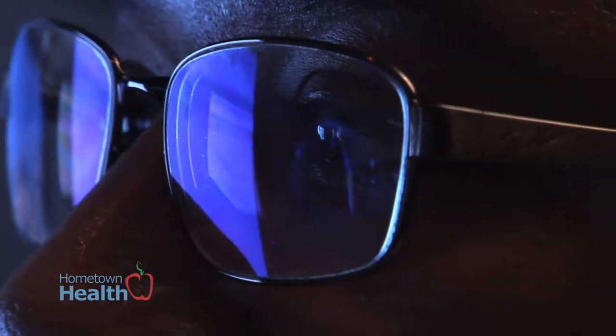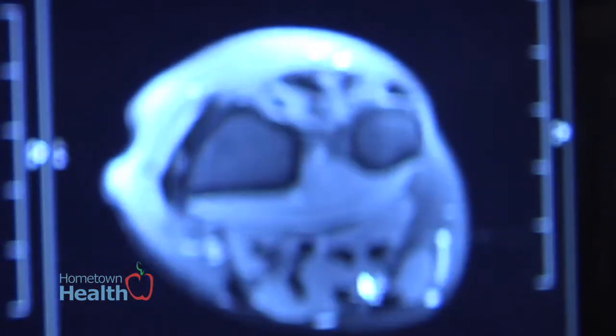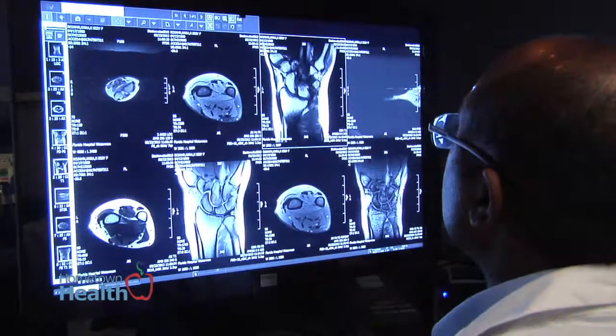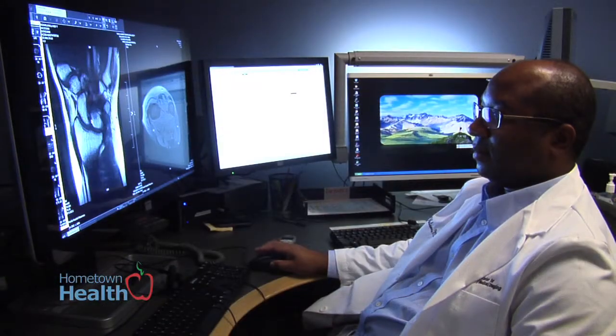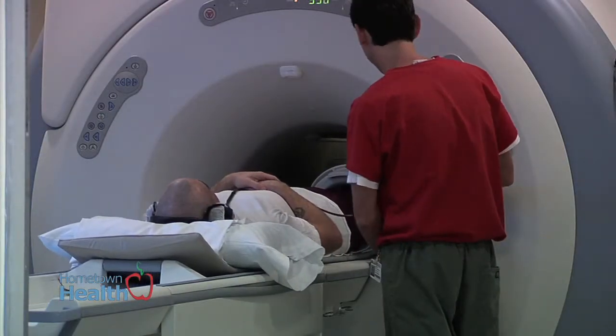In MRI, there are three main findings that we are able to detect in patients that have inflammatory arthritis. The first is synovitis. Synovitis refers to an inflammation of the lining of the joint. So on MRI, we can detect increase in volume of synovial fluid, because in patients with an inflammatory arthritis, a greater volume of fluid is produced. This is long before any X-ray findings may be observed. And so that's one of the key features that we look for.